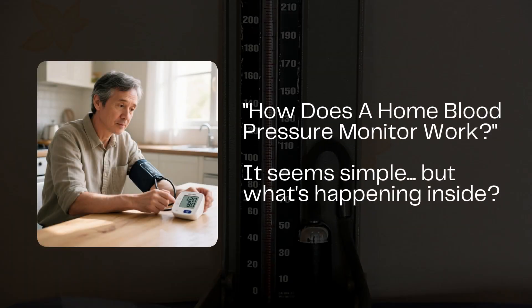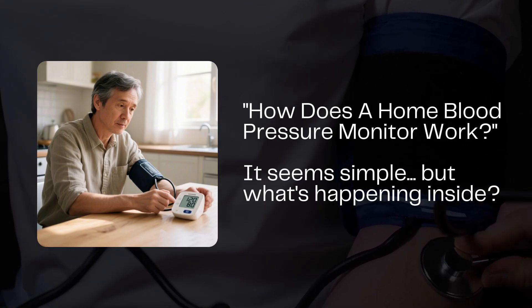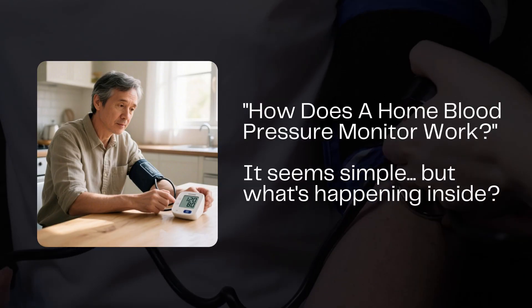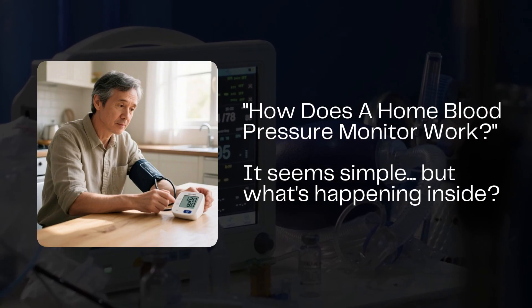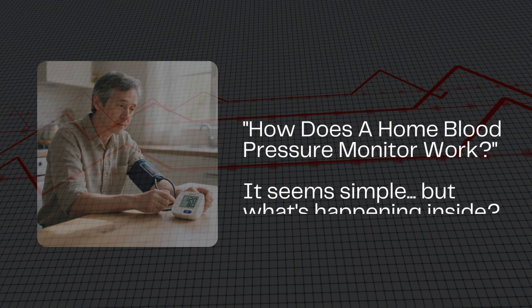How does a home blood pressure monitor work? You strap it on, press a button, and seconds later you're staring at numbers like 120 over 80 and a heart rate of 72. But what's actually going on under that cuff? Is it listening to your heartbeat? Squeezing your artery? Reading your pulse with magic?